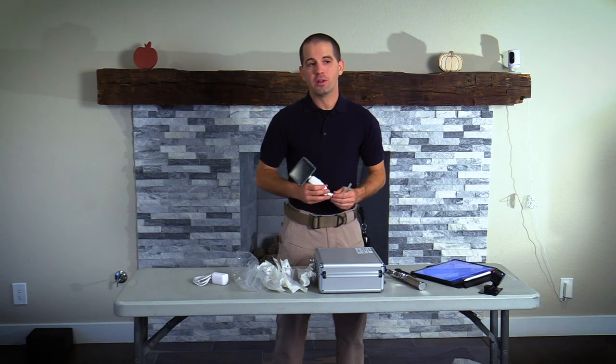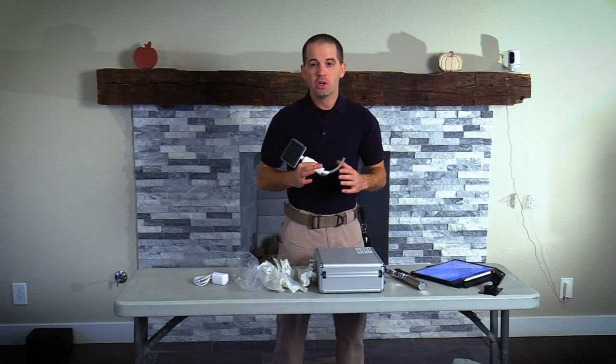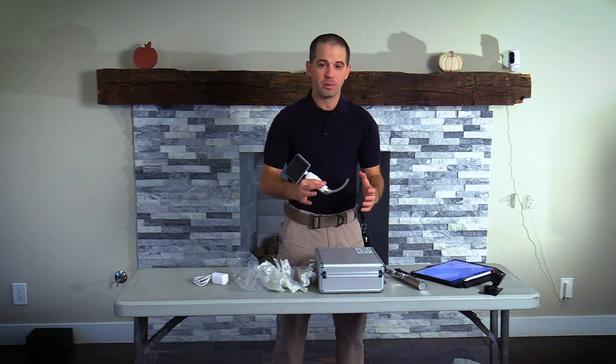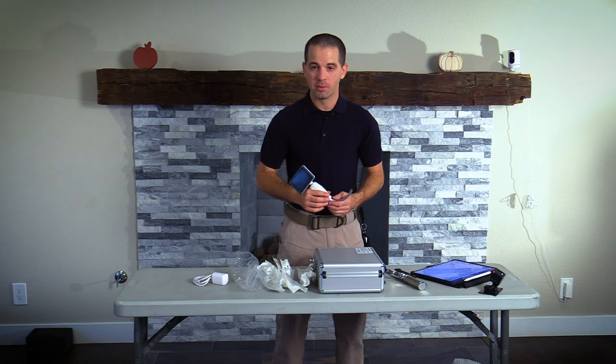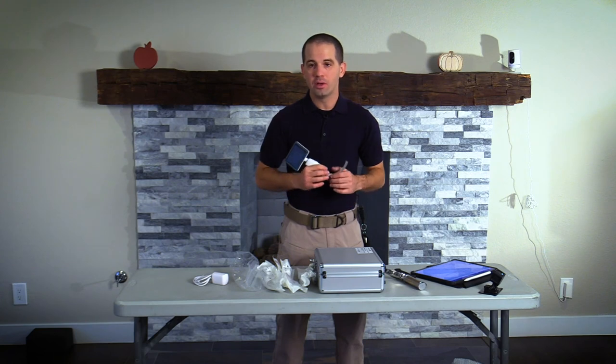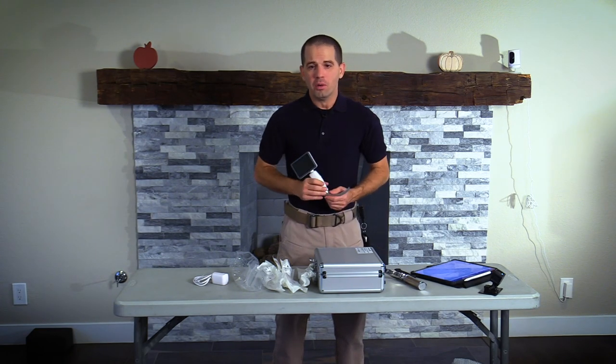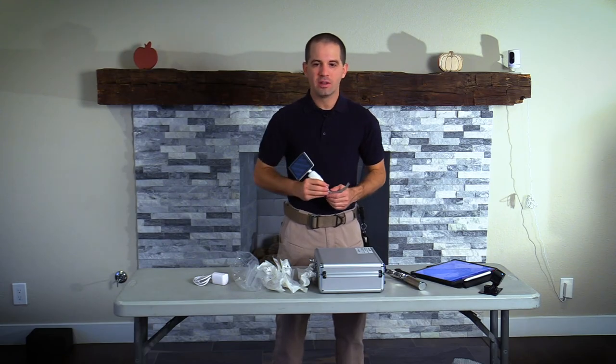Final thoughts on the Clearview Video Laryngoscope: if your agency is not using video laryngoscopy, you should be making that consideration. The Clearview is a great device that I would highly recommend for any agency looking to get into video laryngoscopy. Let me know in the comments below what you're currently using or what your agency is looking to switch to.